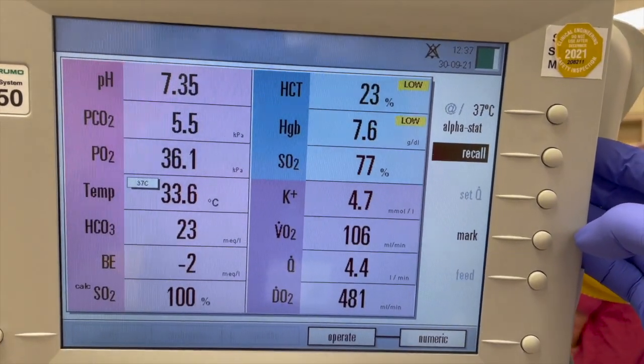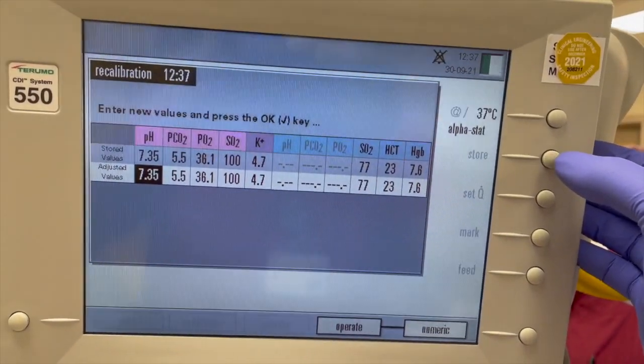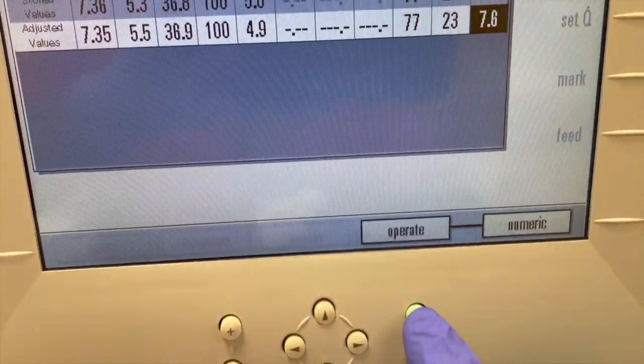CDI has to be calibrated with the first bypass blood gas. When the sample is taken, CDI readings have to be stored for reference. When the blood gas results are back, CDI has to be recalled and parameters re-adjusted respectively.